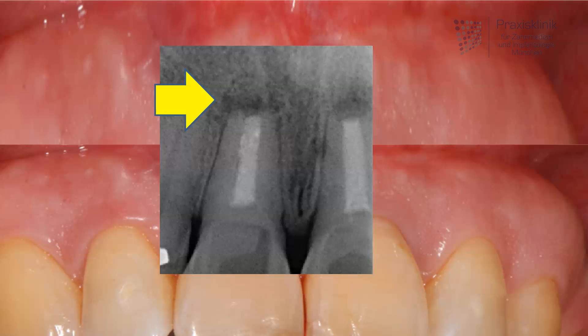This small yellow arrow indicates the inflammation on the tip of the roots, which have been removed by a previous apicoectomy. This apicoectomy has not been successful — as you can see, the bone inflammation always looks a little bit darker on the x-ray than healthy bone.